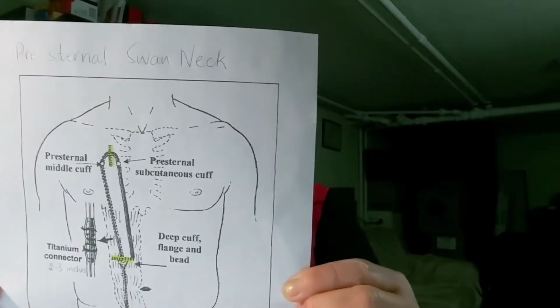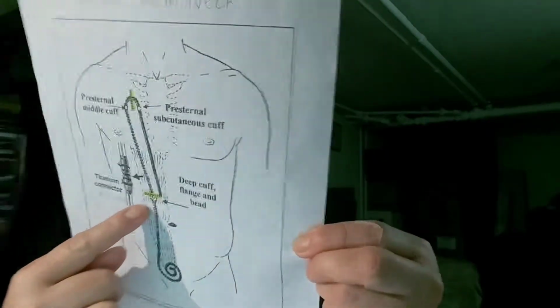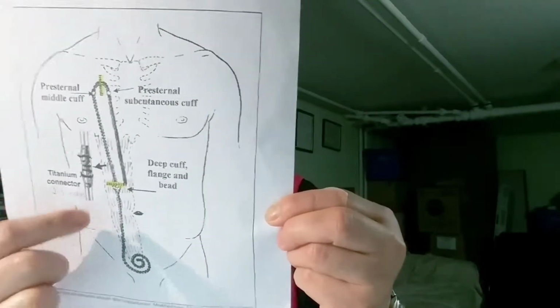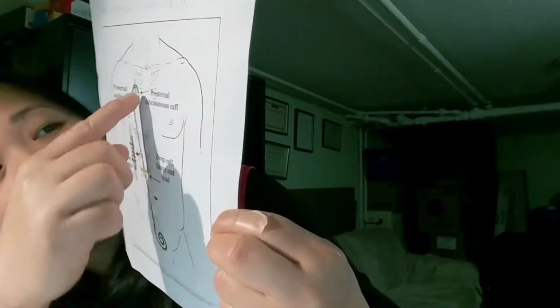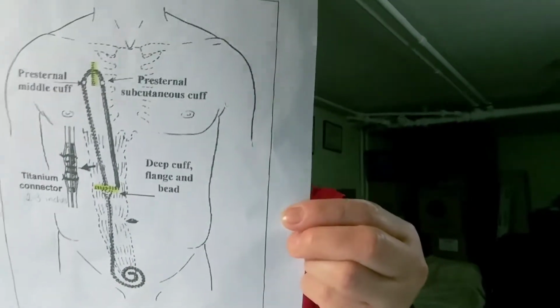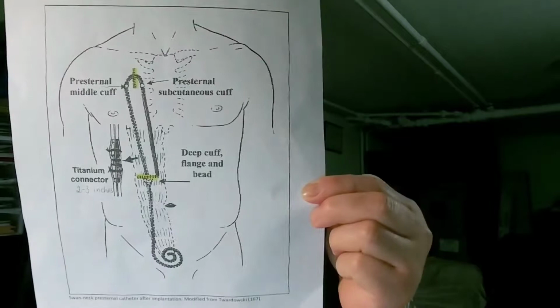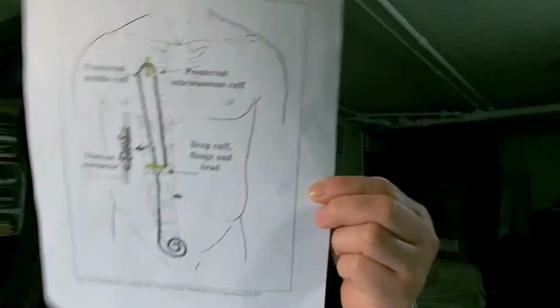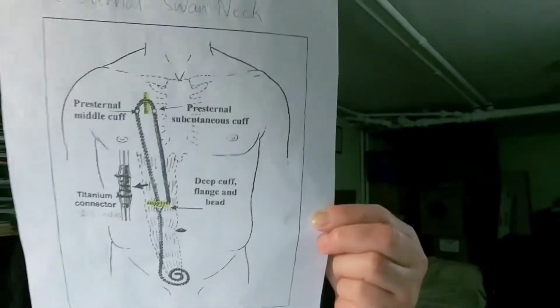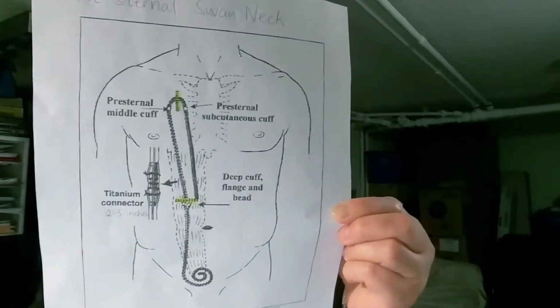This catheter is composed of abdominal and pre-sternal parts joined by the titanium connector here in the subcutaneous space of the epigastrium, and the exit site is located on the chest wall. The main indication for this kind of catheter is for those who are morbidly obese, if they have ostomies, are incontinent, suffer from multiple exit site infections, and to avoid trauma to the exit site. And also for those who want to continue their tub bath.